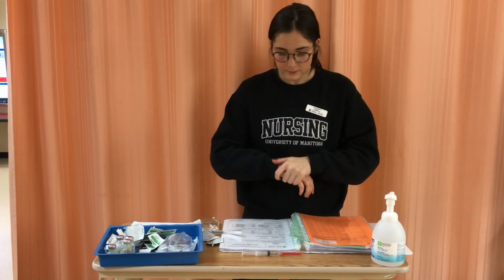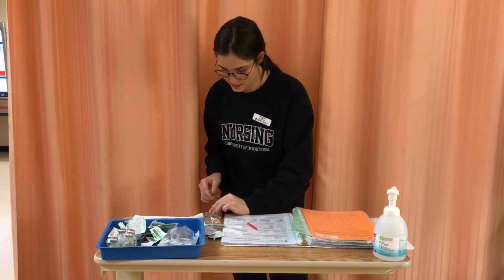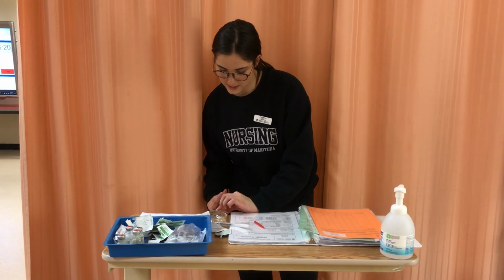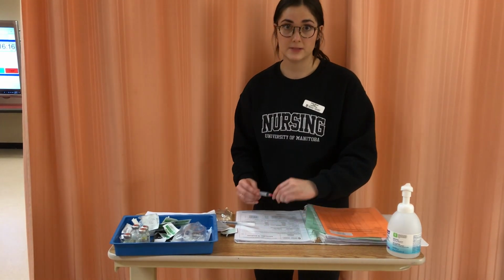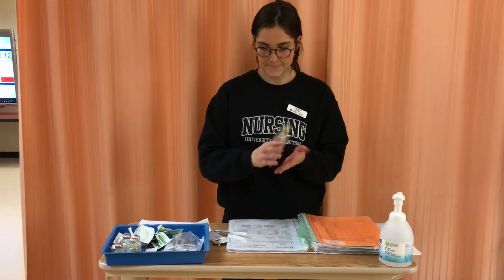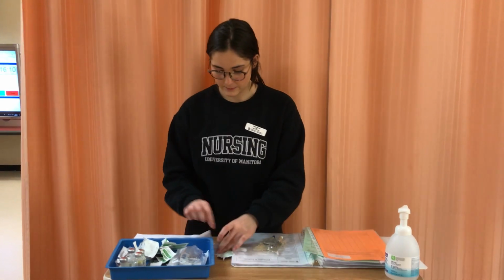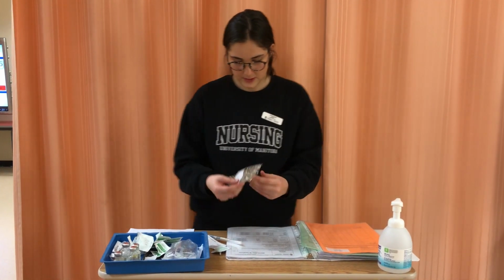And I would have done hand hygiene before that as well. Okay, so now I'm going to grab my needle and insert it into the bag, inject my medication, and put this in the sharps container right away. And now I'm just going to mix this and label it. Okay, so that's my label.